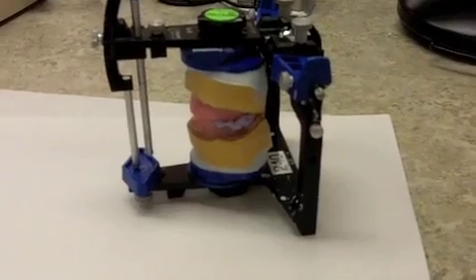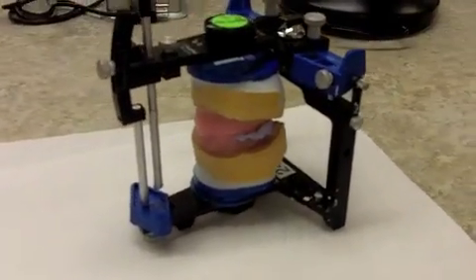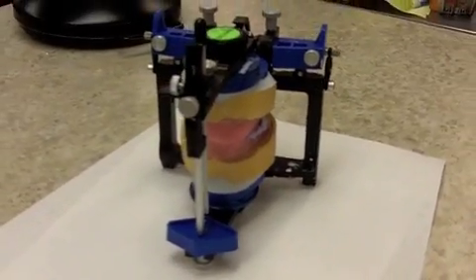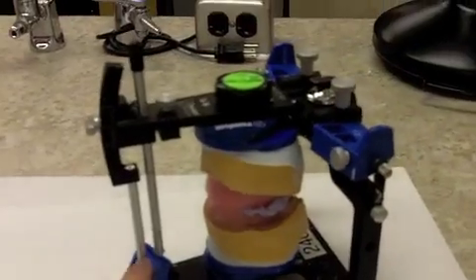So here we have everything mounted, everything's in the articulator, we have our pin set at 0. We are now ready to set some teeth on our simulated patient, which is what we're going to be starting to do next week when we talk about anterior teeth.